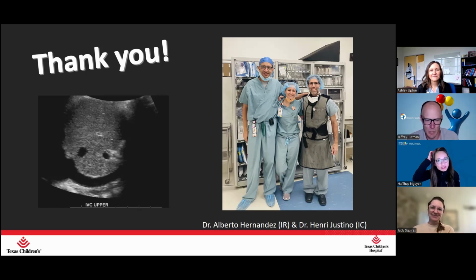I guess just a quick question on billing. If you do end up doing both the liver and the spleen elastographies, do you bill for two organs, or are we not at the stage where we bill for spleen yet, just because it's not really used clinically? Yeah, I think we're at the stage where we're not billing for the spleen just yet. Number one, we're trying to figure out if it can be done consistently and reliably. So we're still trying to figure that part out. I think we can, but it's just going to take a little bit more time to get it figured out. So no, I think it's just one charge for the elastography, and we're including the spleen with the liver.